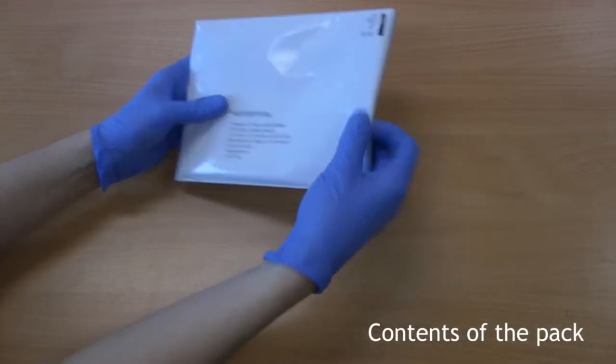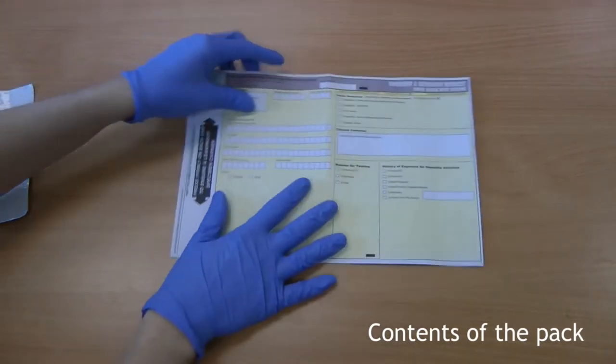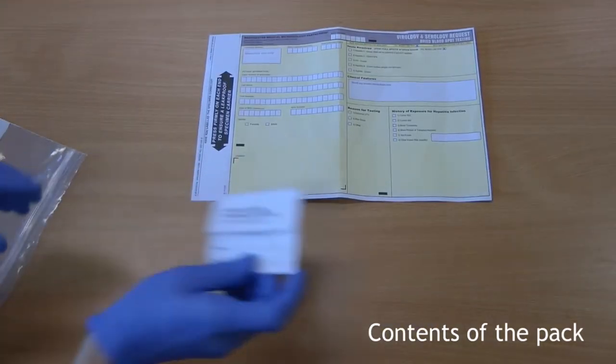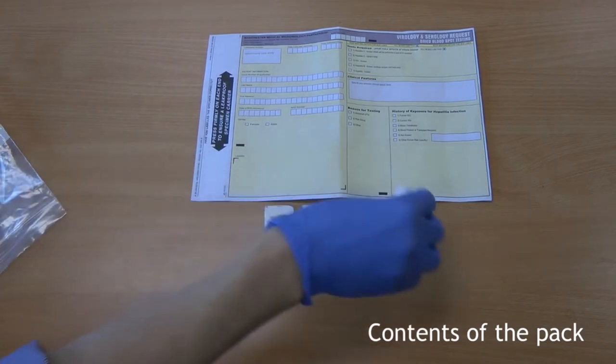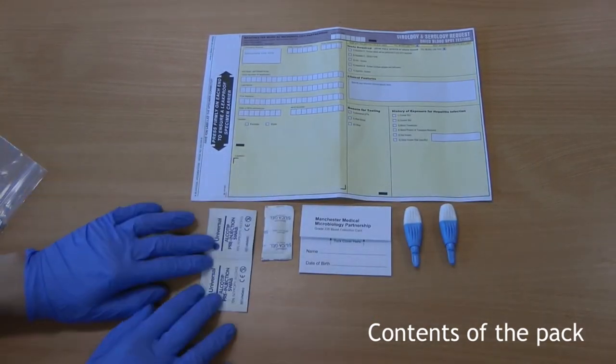In the plastic envelope, you will find a request card and a plastic bag containing a dried bloodspot card, a desiccant pack, two blue lancets, two alcohol wipes and two plasters.